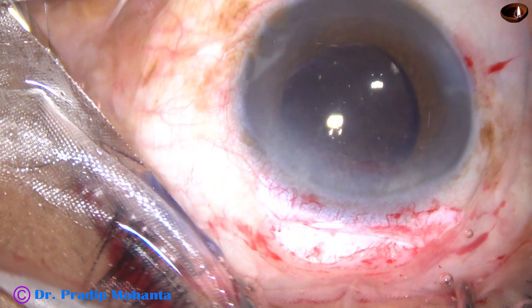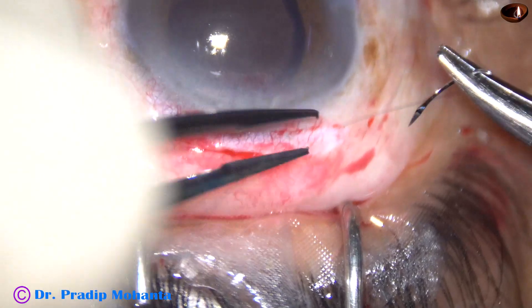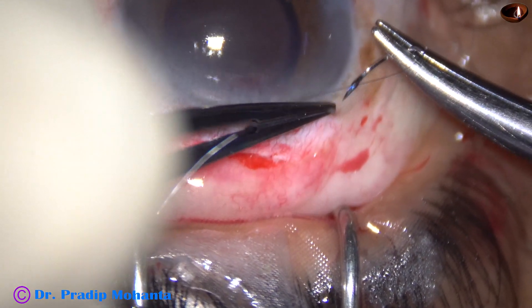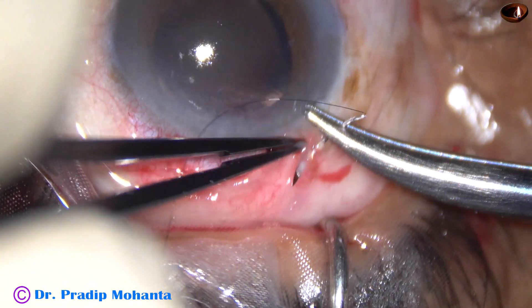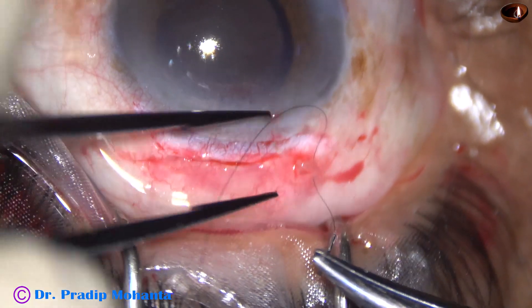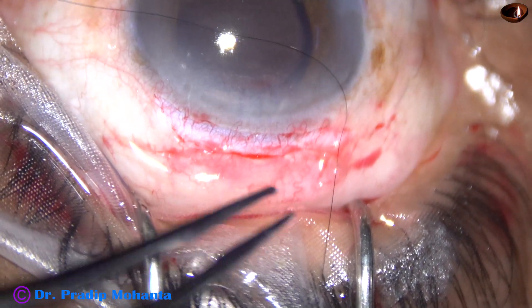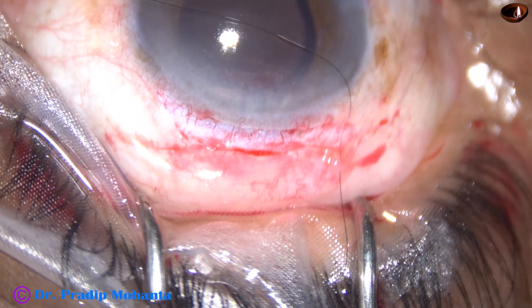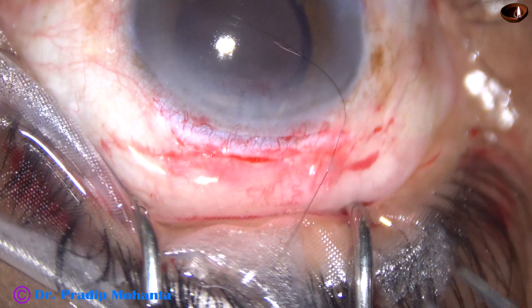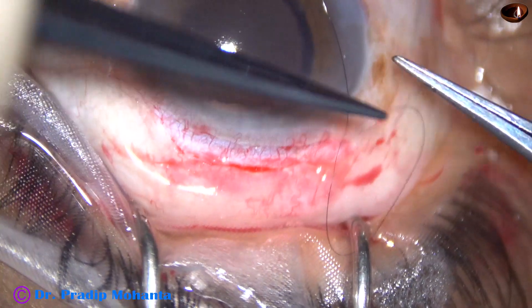And now, the releasable suture. Please watch this very carefully. Take the bite on two sides. Pull the thread. I am going to show the releasable suture very slowly so that you can do it. Take three loops.